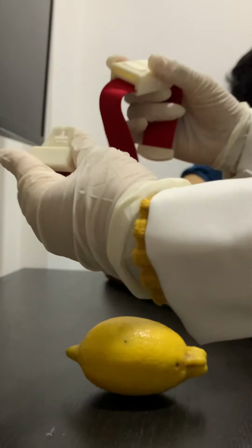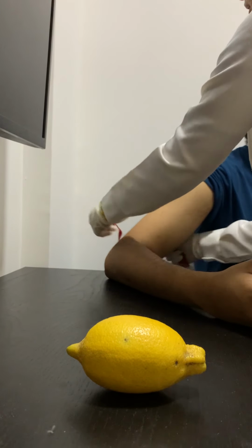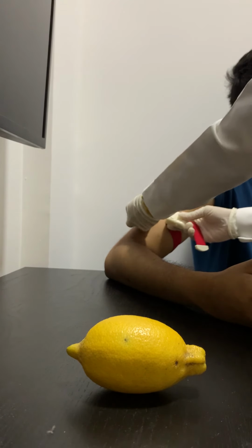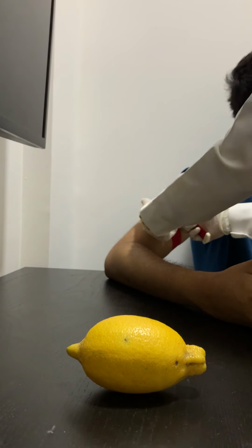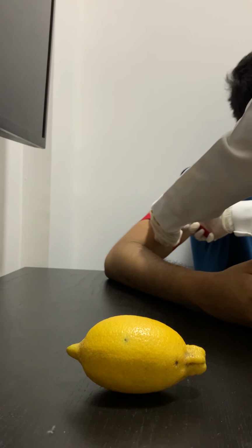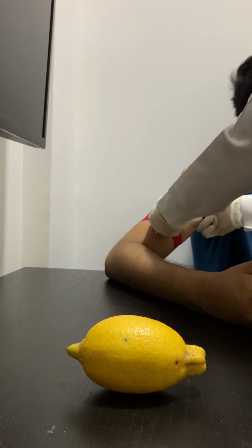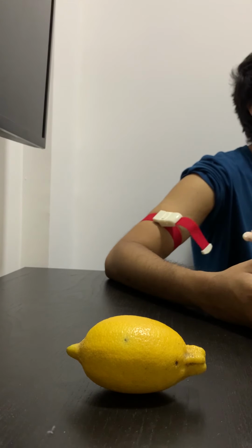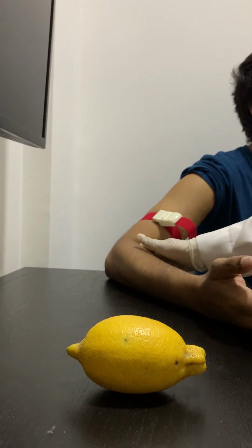Place the tourniquet with both clips facing upwards. Upwards like this, and then clip the ends together around the arm. Then place a finger under the clip so the skin isn't pinched. Next, we should pull the end to tighten as such. At this point, we can ask the patient to clench and unclench the fist. This way we can see the dilation of the cubital vein.